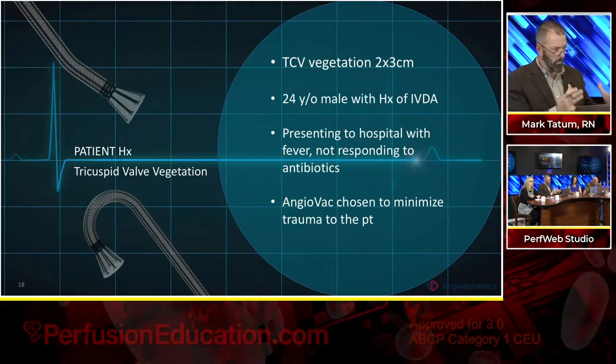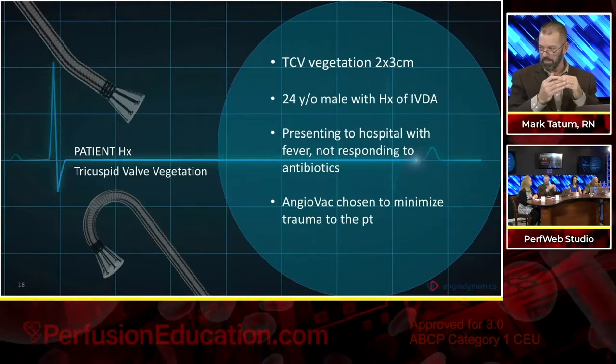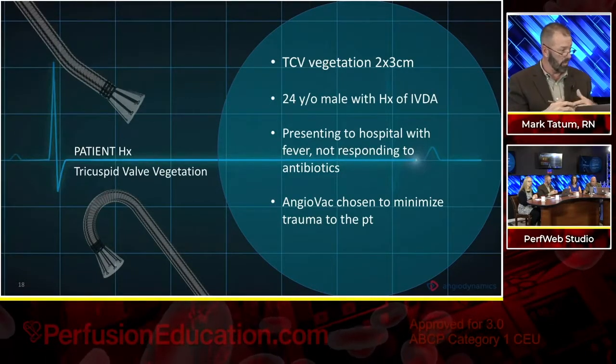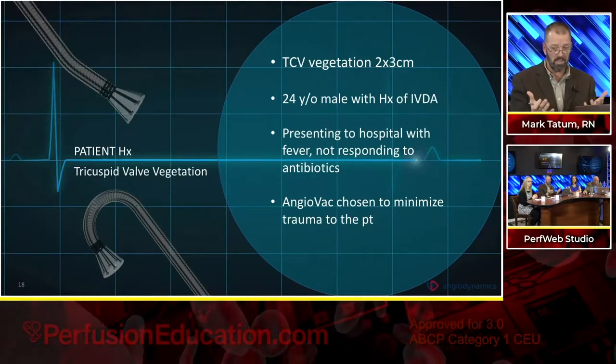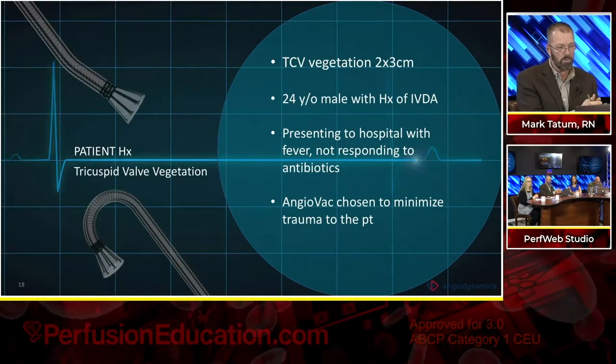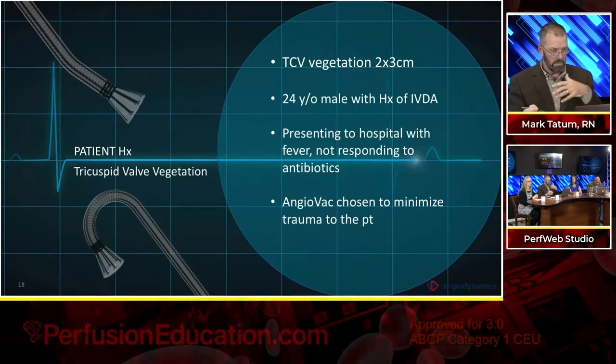If you look at our imaging modalities for things that happen at the SVC or really the caval atrial space and through to the pulmonic valve, we would like to see TEE imagery. Sometimes we'll get a TTE image, sometimes a TEE image. The difference is this.